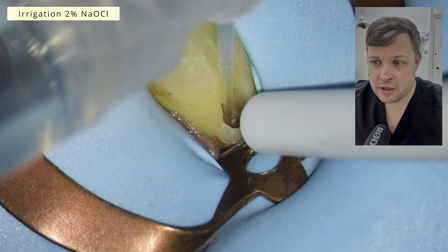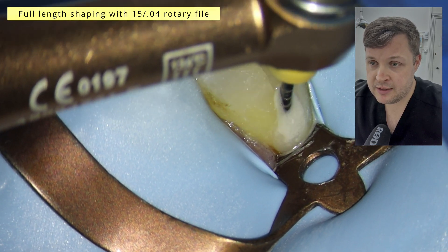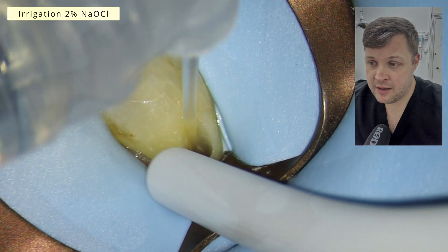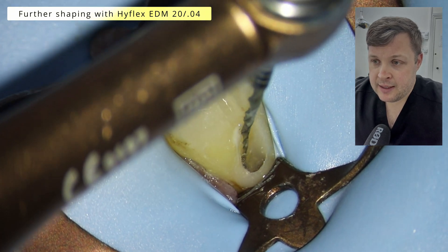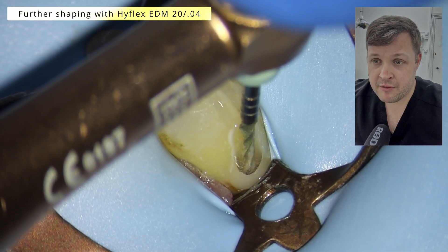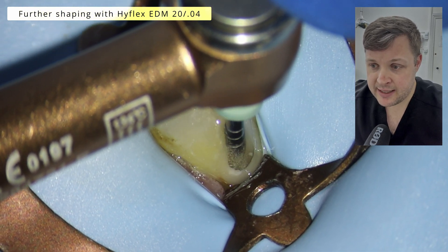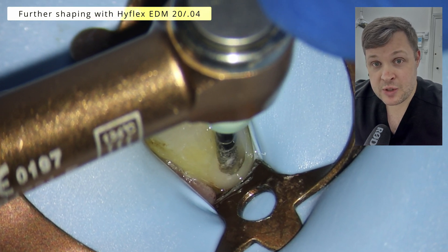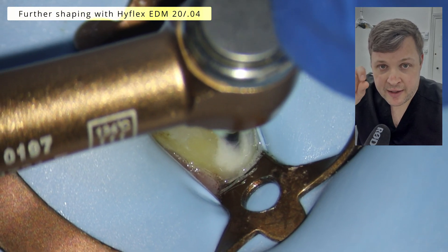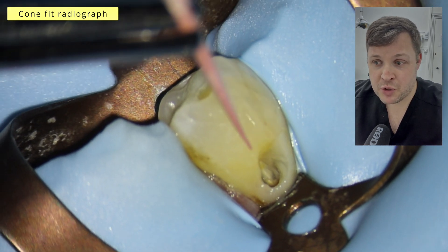You'll notice throughout this video I'm using loads of irrigation. I'm now using the rotary file — the 1504 HyFlex — and this goes all the way to length. Once we've shaped out whatever was getting stuck, these rotary files got nicely to length. I'm going to increase the taper and tip size with a 2004 shaping file. When I'm having trouble getting to the end, I like to use T-mode on my AI motor. T-mode watch-winds the file, and when you've just got past the point where you were getting stuck, you press another button and it turns.